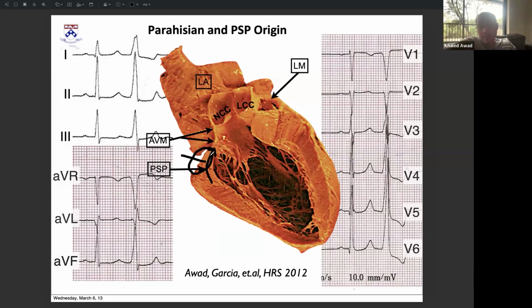And that's where the slow pathway of the AV node is when you do slow pathway modifications. And that's where the ostium of the coronary sinus is, behind that area. And when you ablate mid-septal pathways, if you think about all of these things, you will realize that it was this area that you were working with all that time. You can get PVCs in this area. And we had this case where we actually ablated those PVCs from the right atrium, not from the left ventricle.